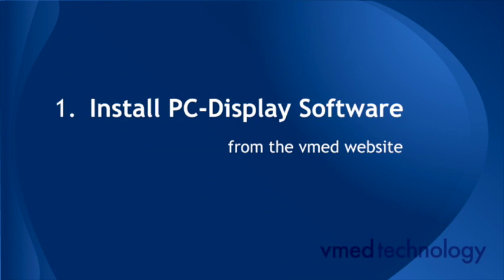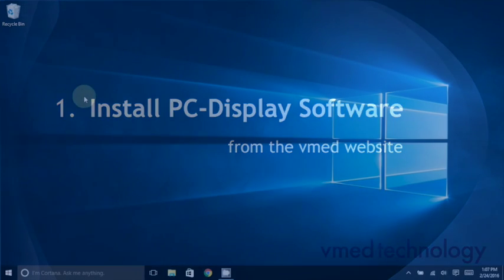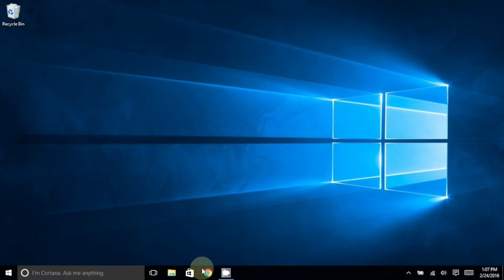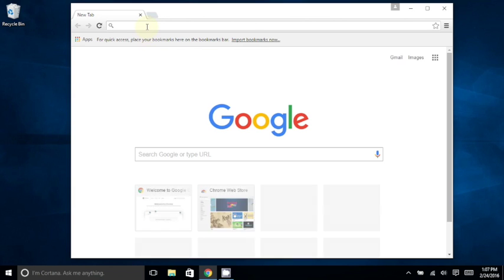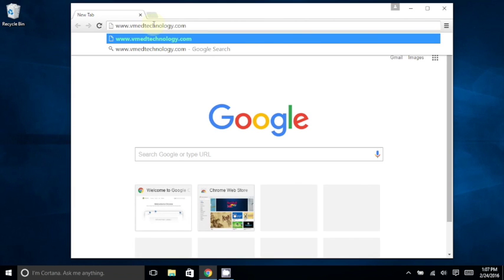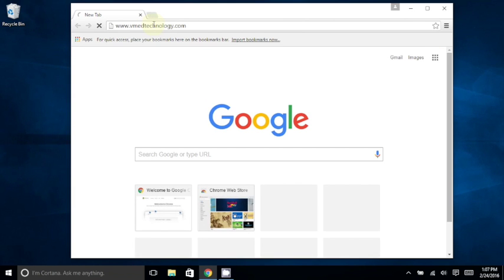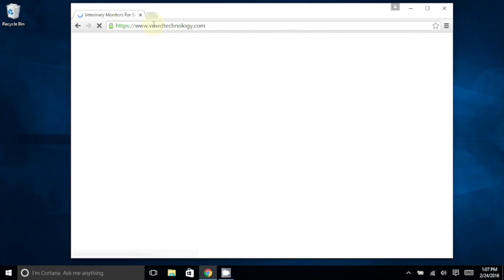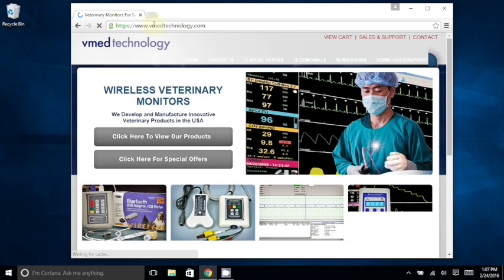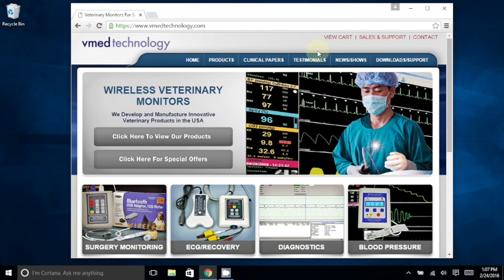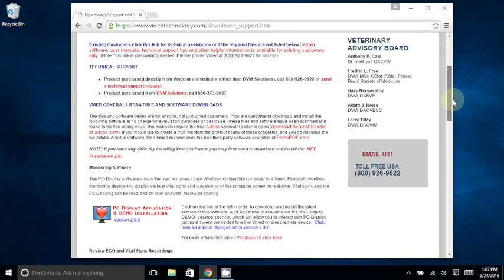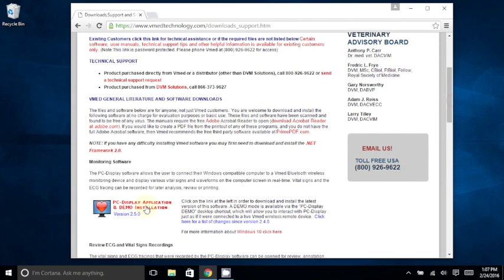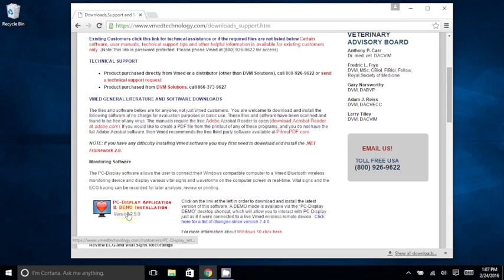If you choose to install PC Display from the VMED website, then open a web browser and go to the VMED Technology website. Click on the Download Support tab, and scroll down until you find the PC Display Application and Demo Installation icon. Click this and allow it to download.